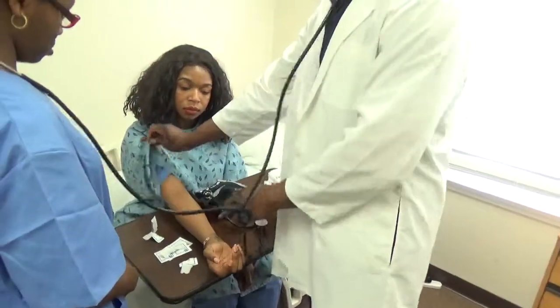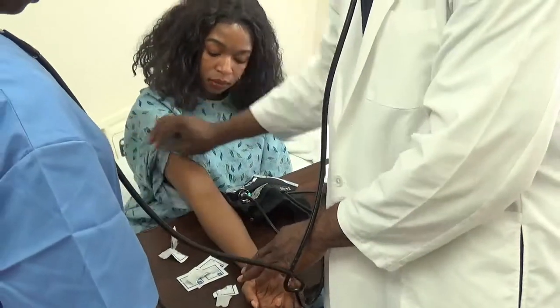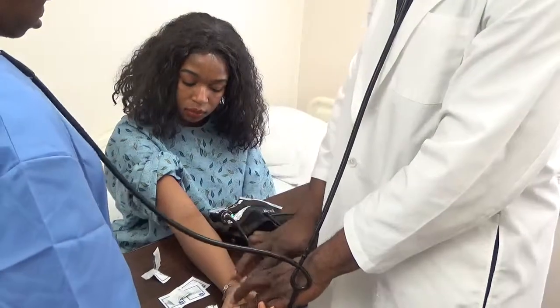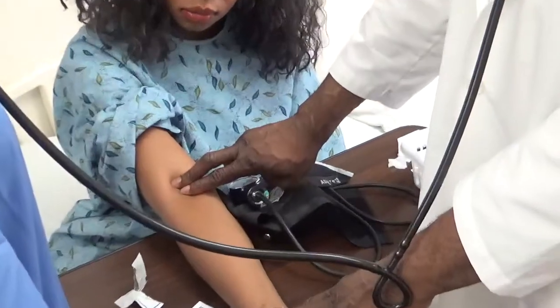Before you place the blood pressure cuff, make sure you locate the brachial artery. It is going to be in the middle there. Just go there and check it for about two seconds.